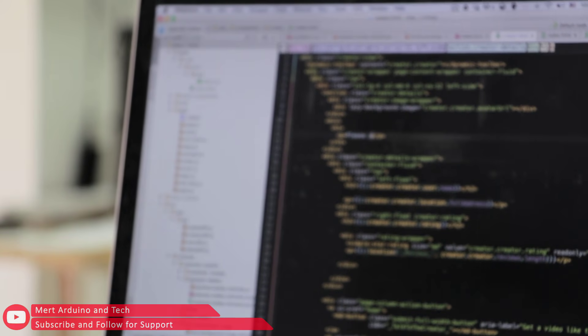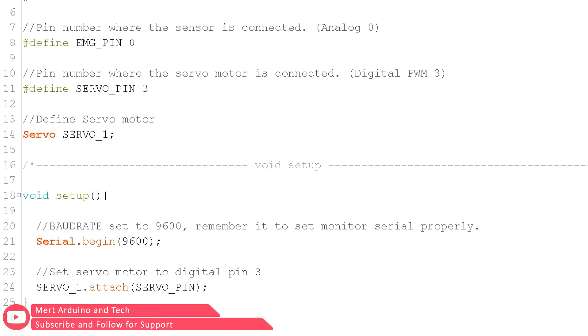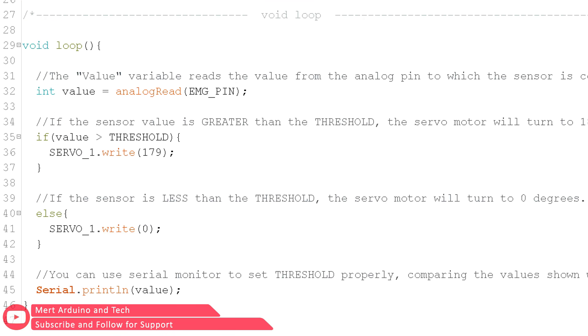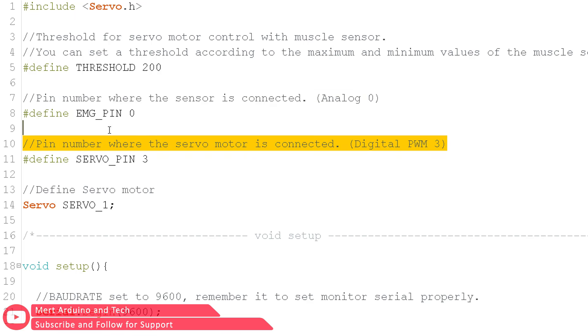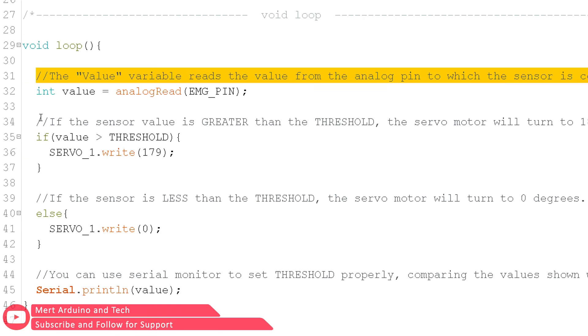Source code to move servo motor according to sensor value: You can find the source code link in the video description. There are explanations in the code so you can understand the code better.